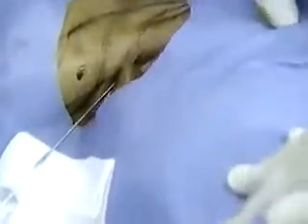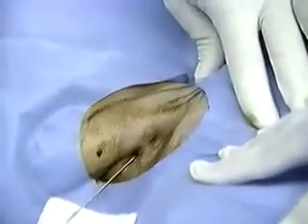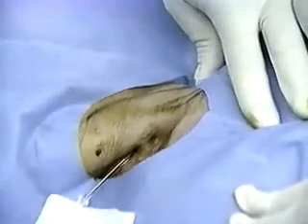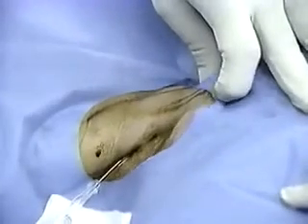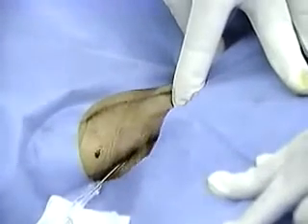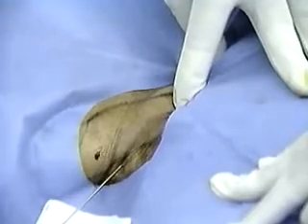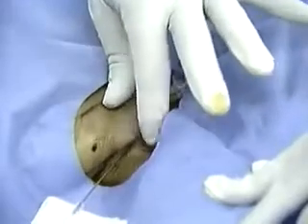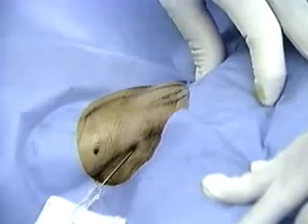Next, advance the introducer needle posterior to the lateral head of the sternocleidomastoid muscle. The needle is directed slightly anterior toward your thumb, which is resting on the suprasternal notch. Advance the needle slowly with negative pressure on the syringe. If the initial pass is unsuccessful, withdraw the needle, palpate the sternocleidomastoid muscle to confirm you are in the right place, and redirect the needle slightly more inferiorly.